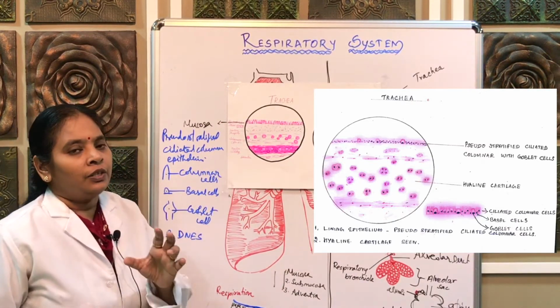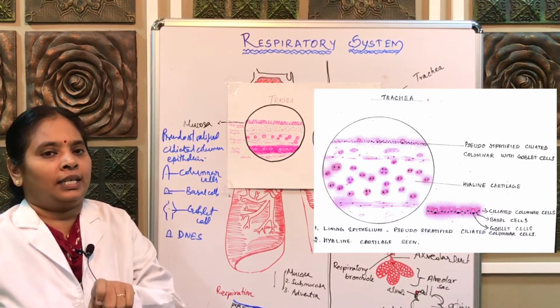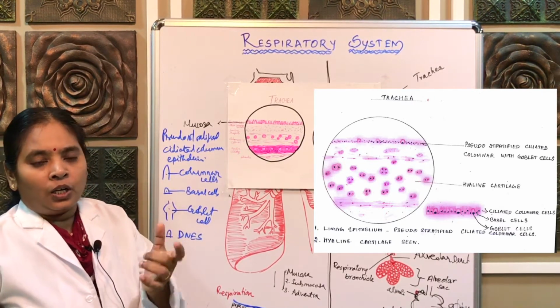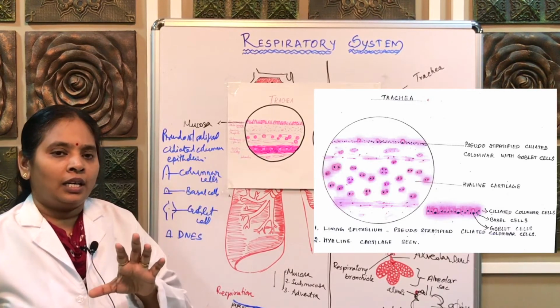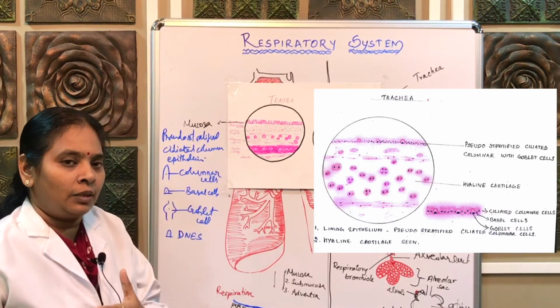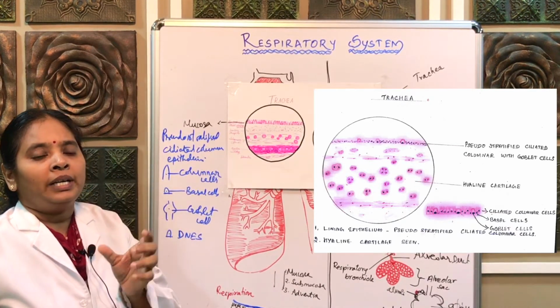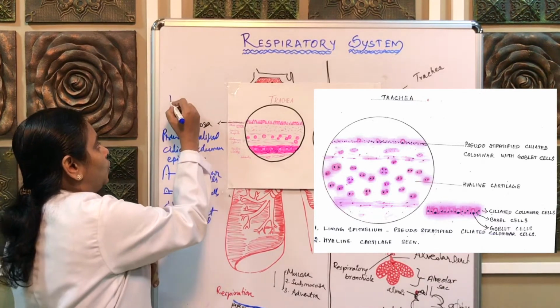So, a trachea slide usually comes as two items, for hyaline cartilage and also for the trachea. It is in the spotter, and also in the discussion you have to discuss the trachea and the hyaline cartilage. So, questions can be asked in both. What about the trachea? Gross anatomical features: it is formed by a C-shaped ring. How many rings? 16 to 20 rings.